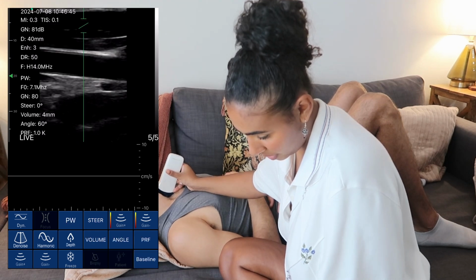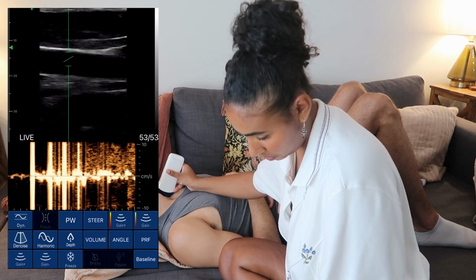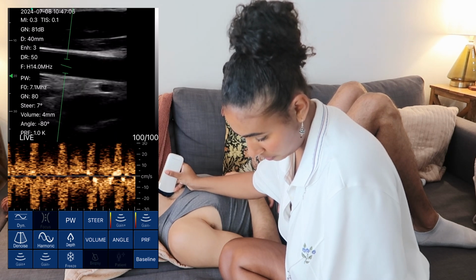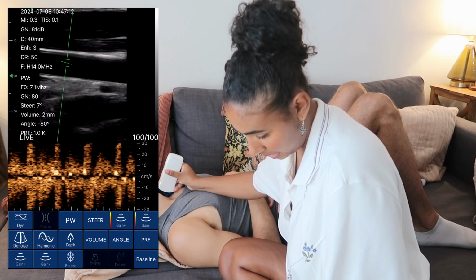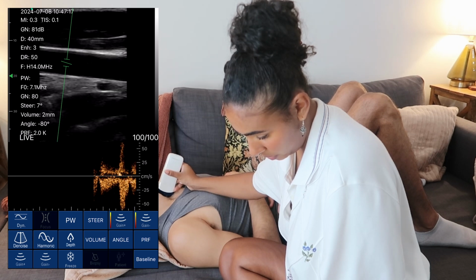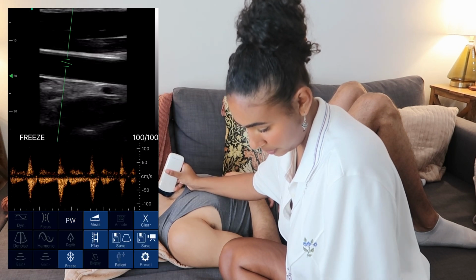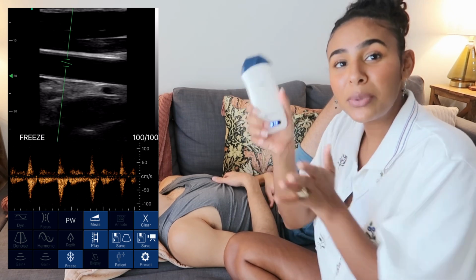Unfreeze. And then let's pulse wave our carotid. We're going to steer and change our angle so that we're as parallel as we can be. Change our gate, sample gate size. And then let's play with our scale a little bit so we can see our waveform. And there we go. Freeze. So that concludes the demo portion of this video. I hope you thought it was super cool getting to see what this probe can do.